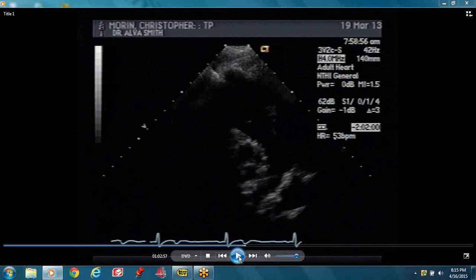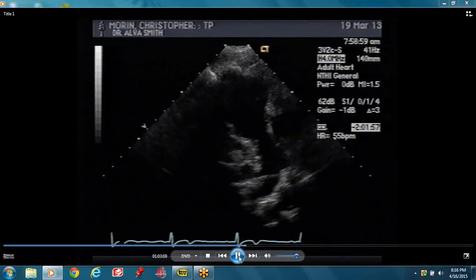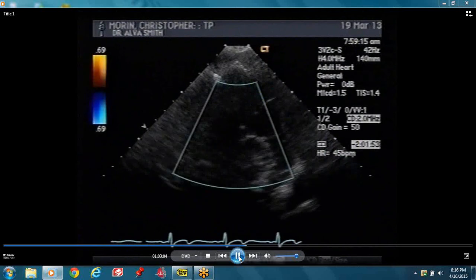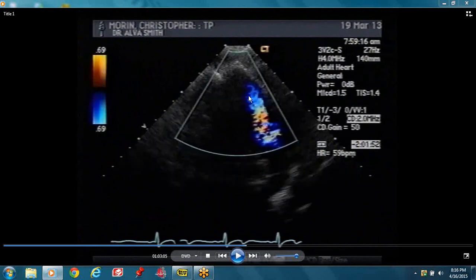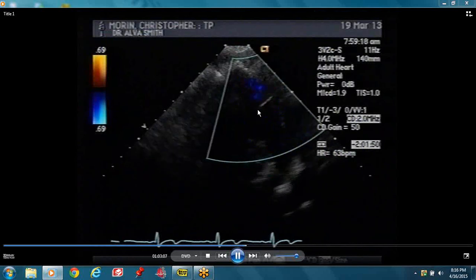From the parasternal long axis view, you can shift to your RV inflow view and go on to your short axis. From that parasternal long axis view, you can get multiple images. She's looking across the pulmonary valve — it's a short axis at the level of the aorta and you concentrate on the pulmonary valve.